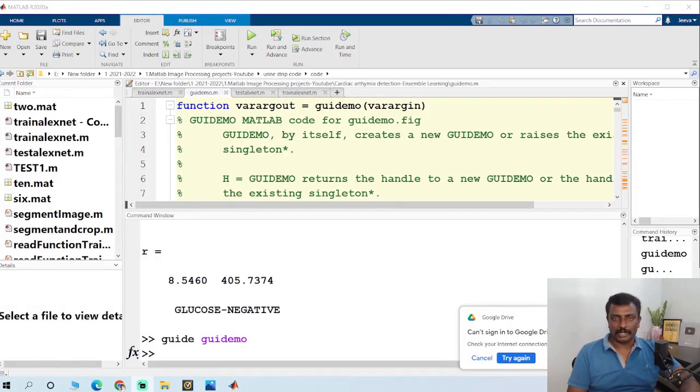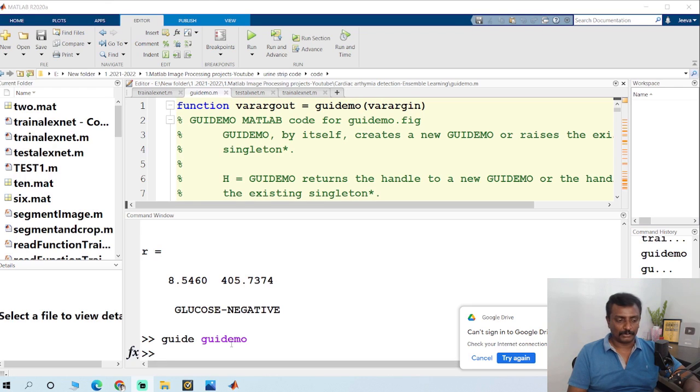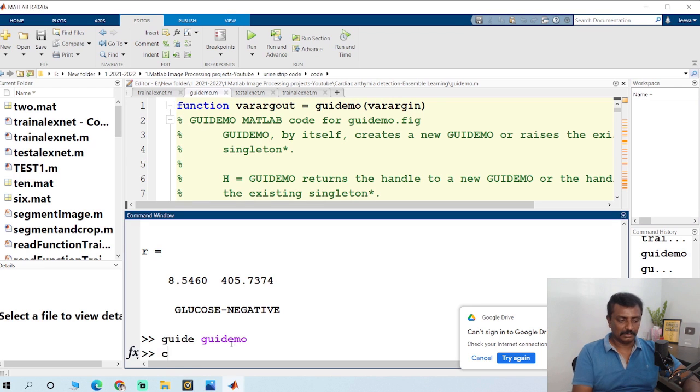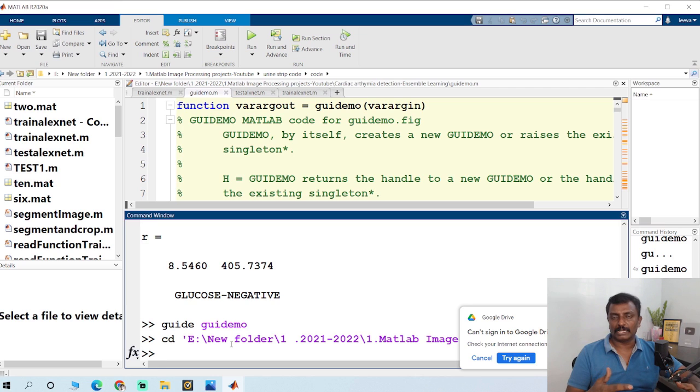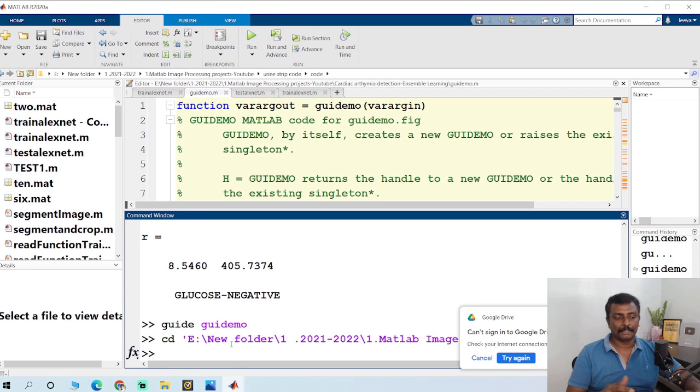The first thing you have to do is change the path of the program. MATLAB will search all the programs and files only in this folder.